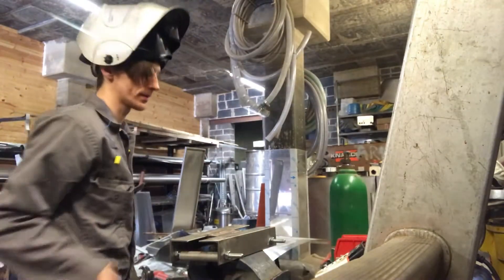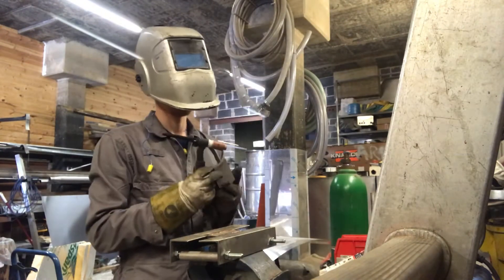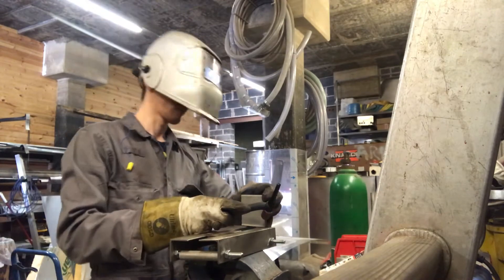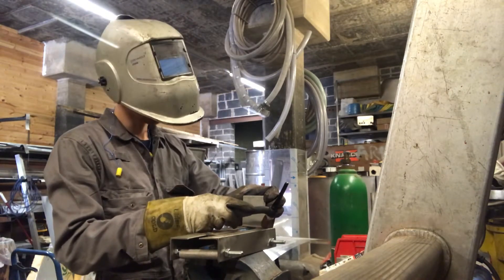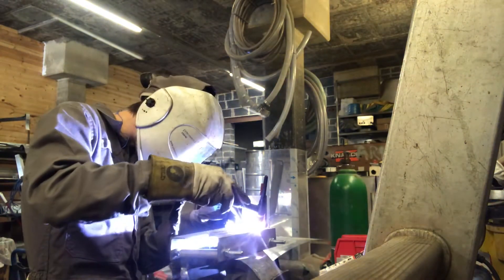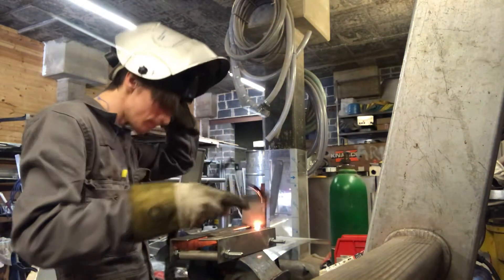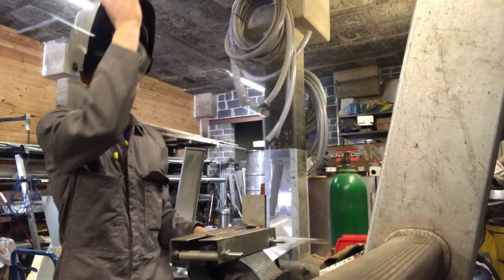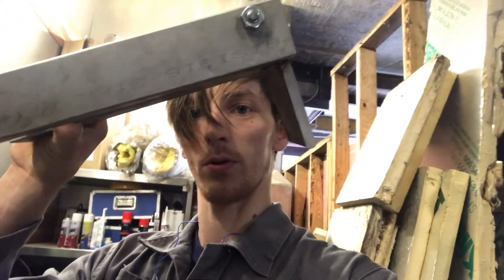Here we go. I'm happy with that. So now it's going to be tilted like this, so hopefully we won't push off the front end.